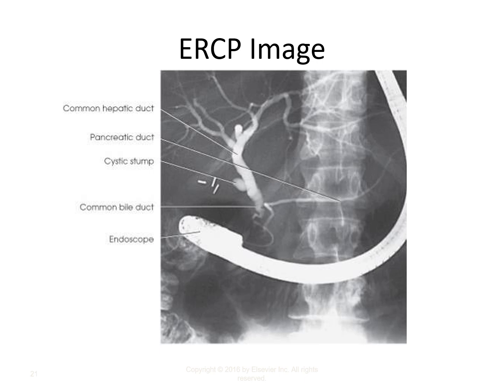This is a negative ERCP. There's no stones present. There's no signs of active stenosis. So it doesn't look like any interventions are necessary. Interventions I've seen personally with performing ERCPs, I've seen stone extractions via sphincterotomy, ballooning the common bile duct, and or using the wire basket to grab and lasso stones and pull them out of the common bile duct.